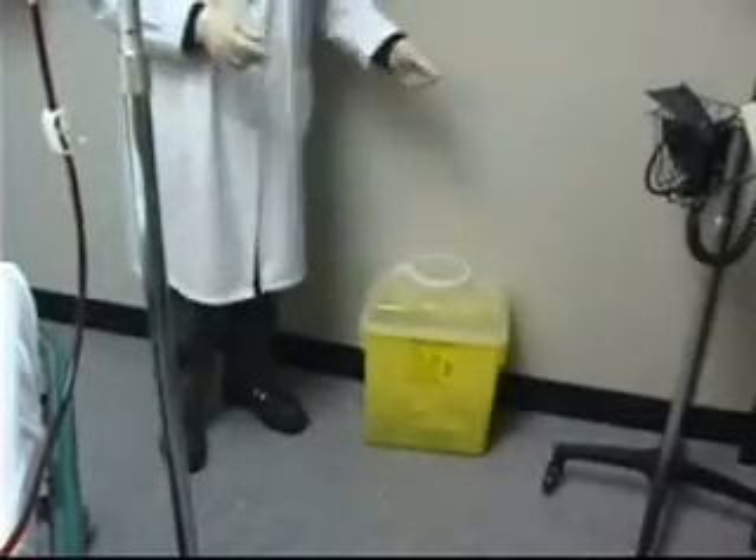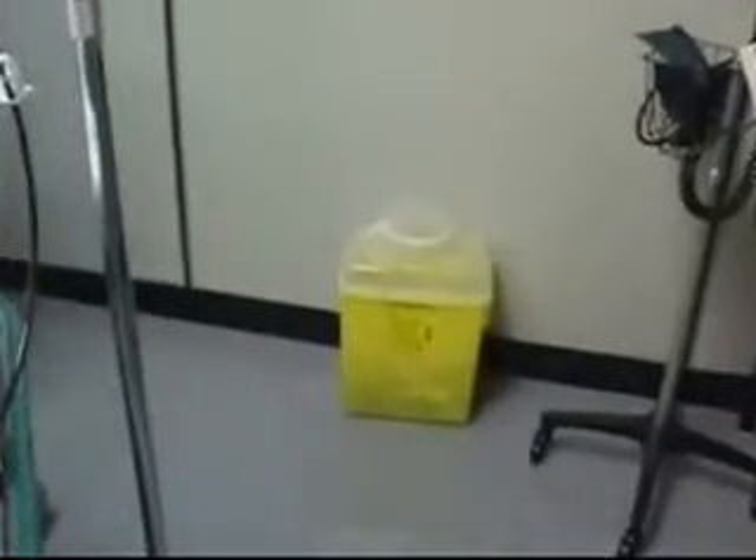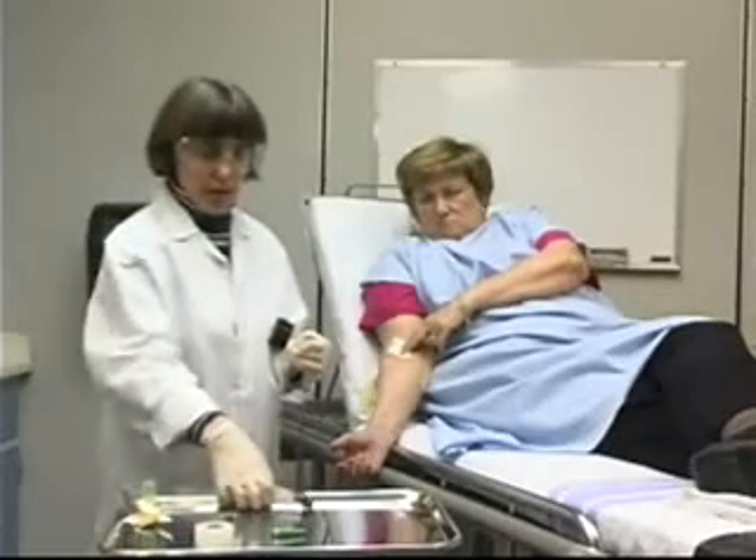I'm now going to dispose of the vacutainer and the needle without recapping the needle into the appropriate sharps container. I'm going to take my blood tubes with the blood — I will label and requisition those and send them off to the lab.